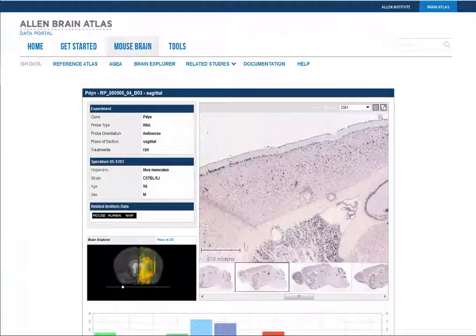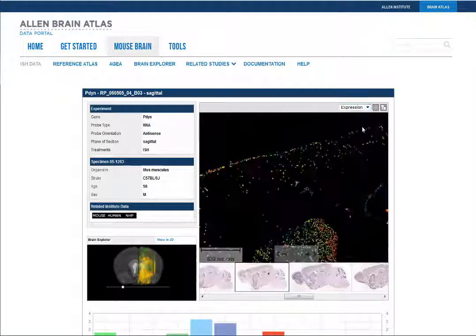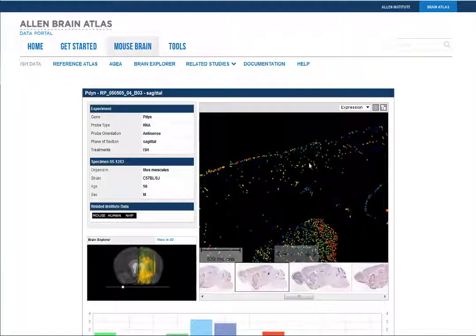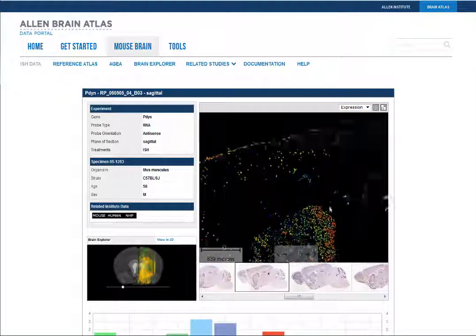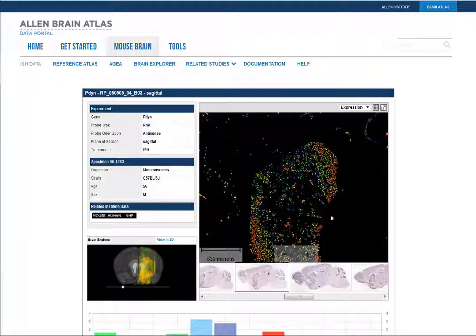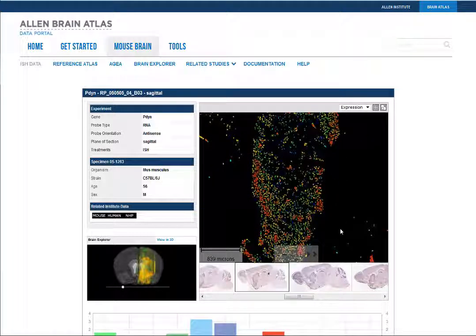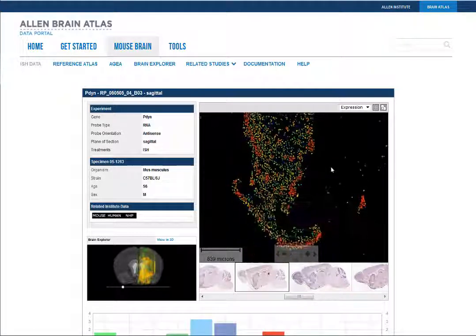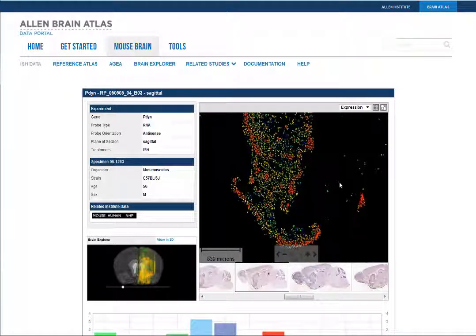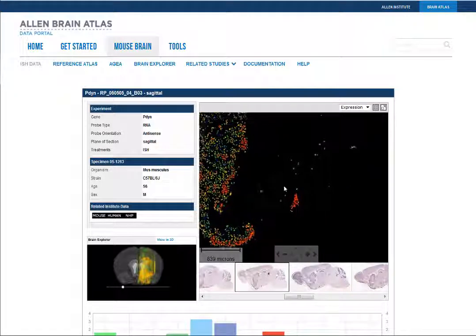The drop-down menu gives you access to the expression mask, which is a background subtraction algorithm which colorizes the expression from cooler colors for low expression to the hotter redder colors for high expression.